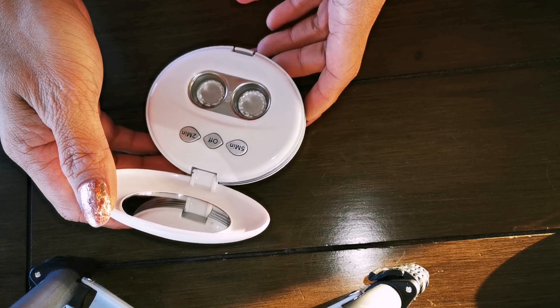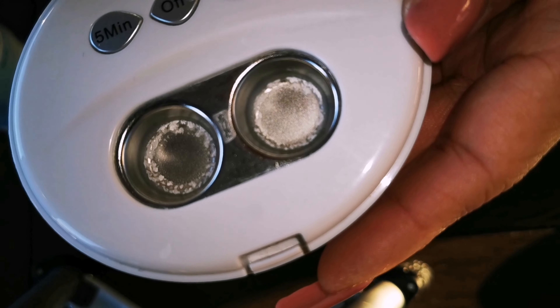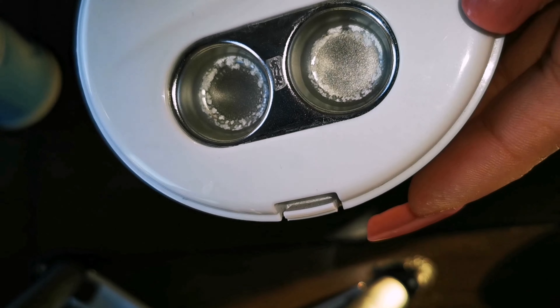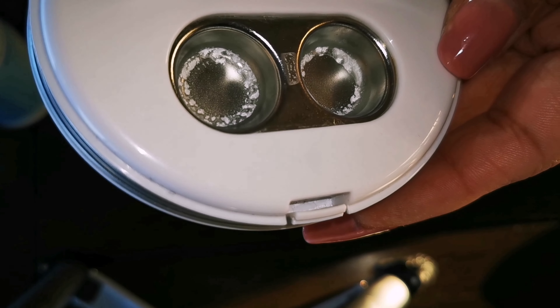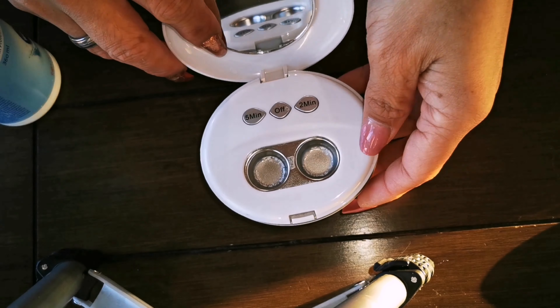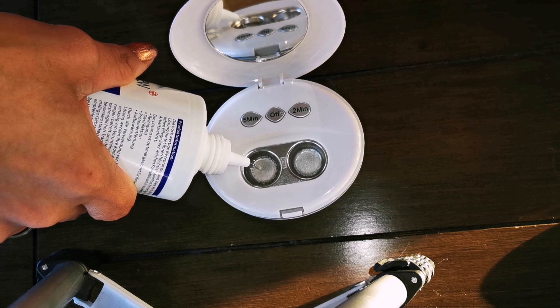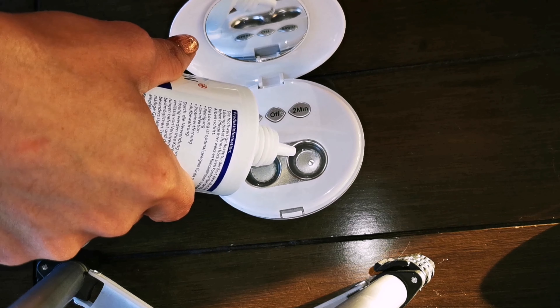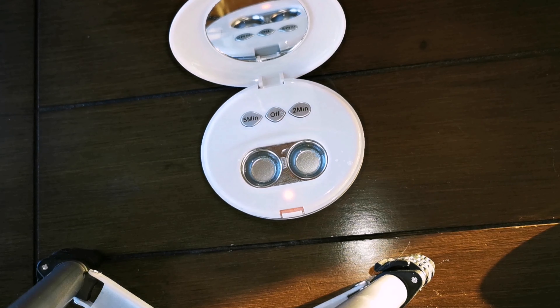You have to clean this device every day. If you don't clean it, there will be buildup and it will clog up. You don't want that getting into your contact lens, which you put directly into your eyes. When that happens, you have to clean your device again with your contact lens solution.